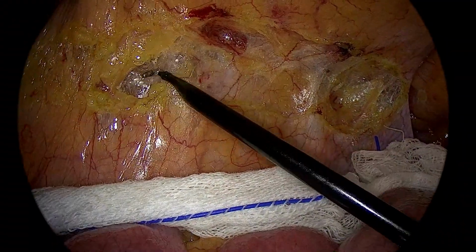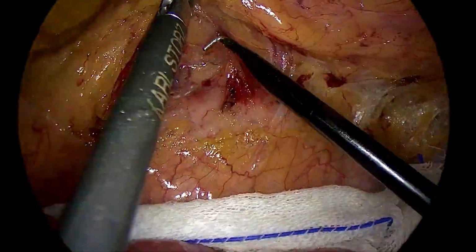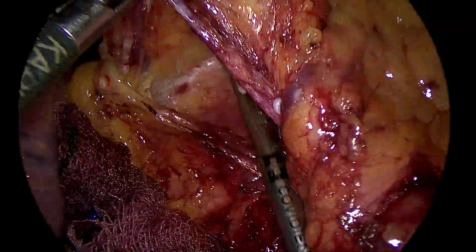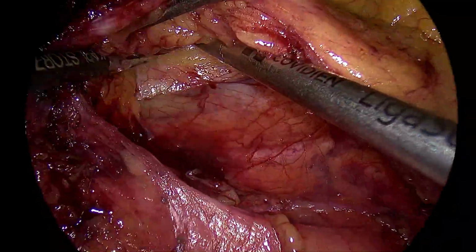Moving on to surgery. After ports insertion and creating pneumoperitoneum, abdominal survey was done, then identification of inferior mesenteric artery pedicle was done. After this we move on to the medial to lateral mobilization of colon.